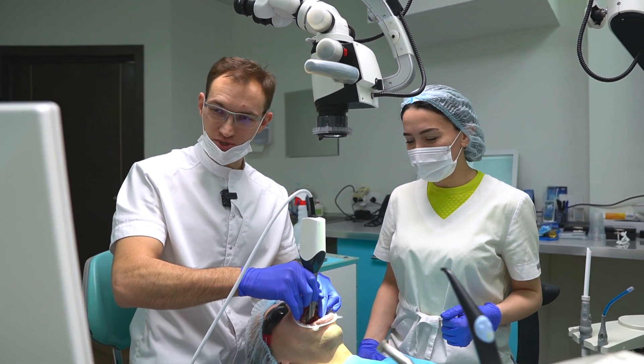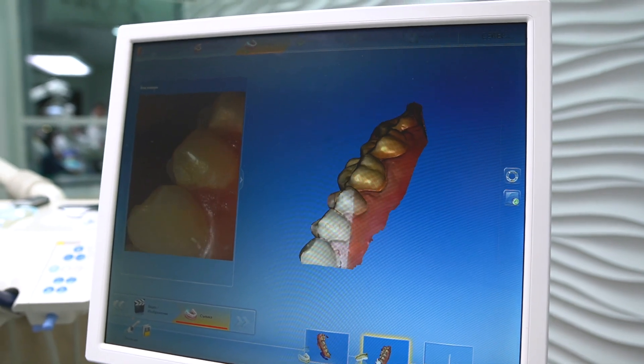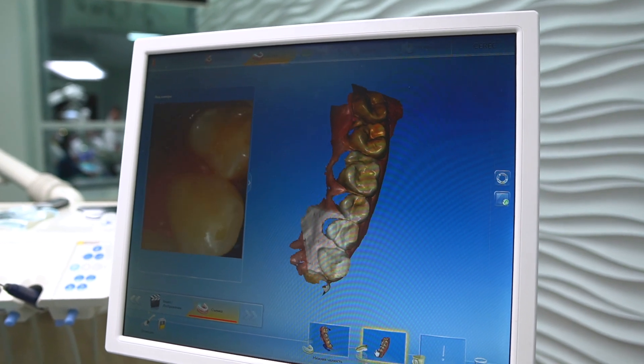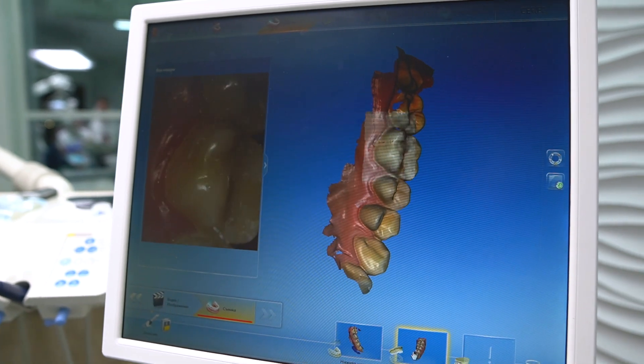Next step, we are scanning the upper jaw. If you don't use classic impressions, it's very, very comfortable for our patient, because we don't use any physical materials — we are only scanning, just like taking a picture inside of the mouth.